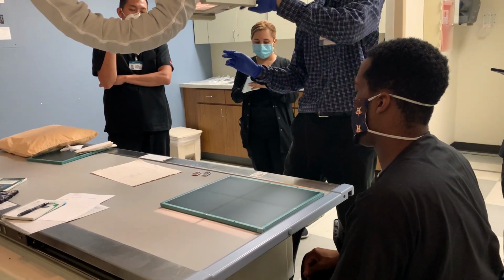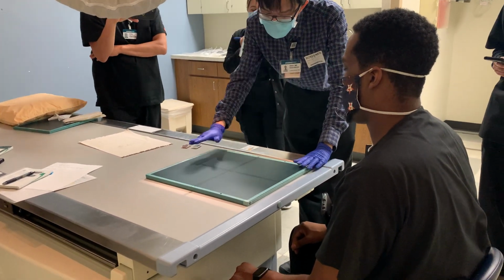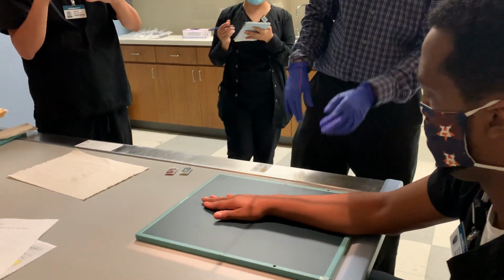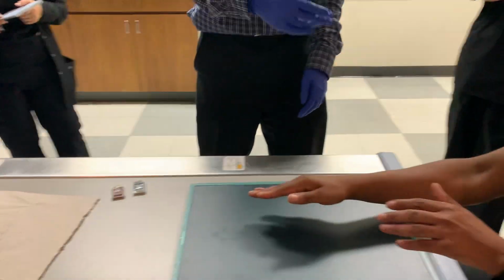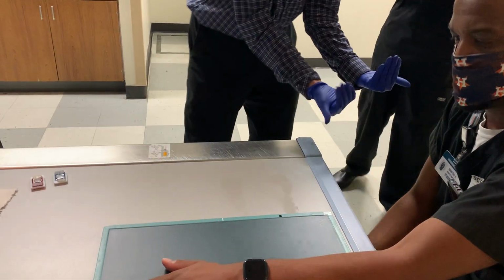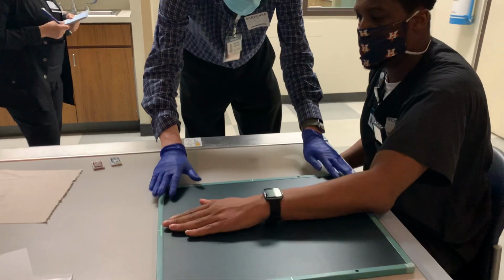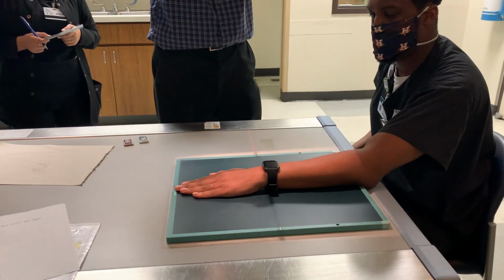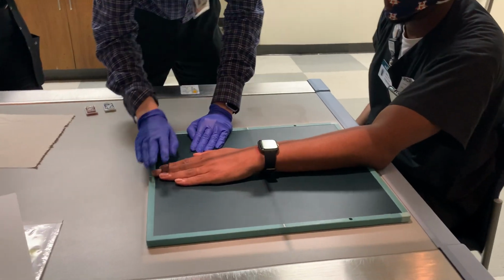Okay, just going to open this up. Okay, nice and centered. You can put your hand down, slide back towards you slightly. Good. Okay, so let's see. Actually, since I drew the hand like this, it might be better if we demonstrate it with the left hand. Scoot your chair over this way, please. Alright, good. Just so that you can get the arm nice and straight. I'm just going to bring this across. Good. Okay, slide back. Good.